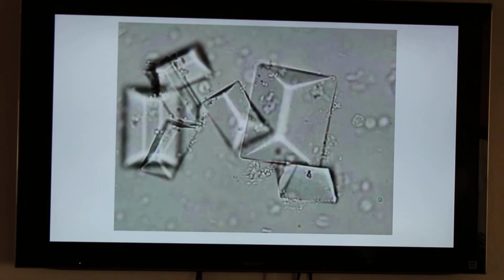This picture is a struvite or a triple phosphate. The coffin lid appearance is what gives this one away. It's found in alkaline urine and usually in a feline patient. Now that being said, typically your calcium oxalate dihydrates are in dogs and struvites in cats, but knowing that it can happen in either species.